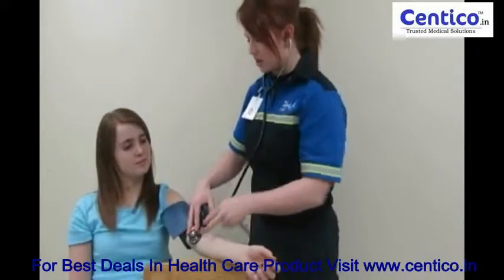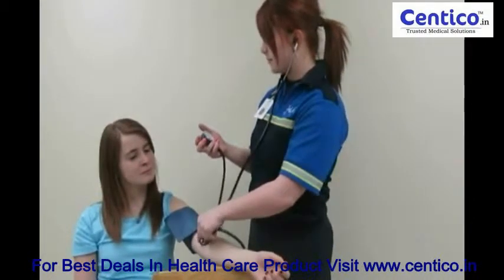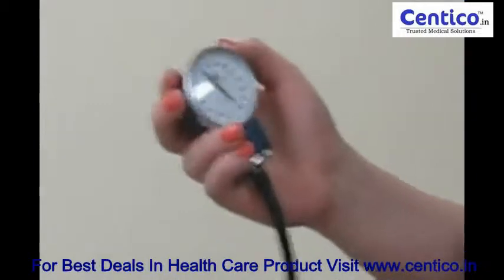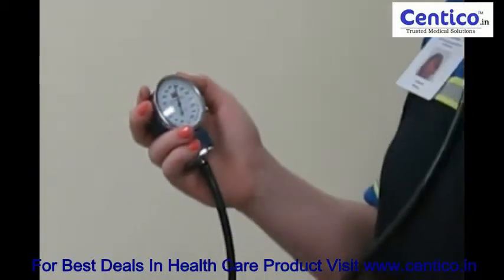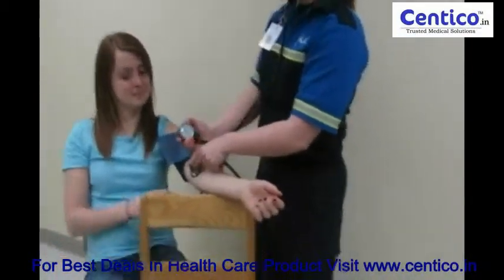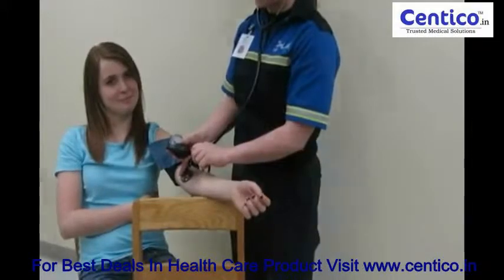Now, as I start to pump, I stop at approximately 160 or 180 mm of mercury. Okay, now I have to stop. After, I have to open the valve very slowly to let the air come out.